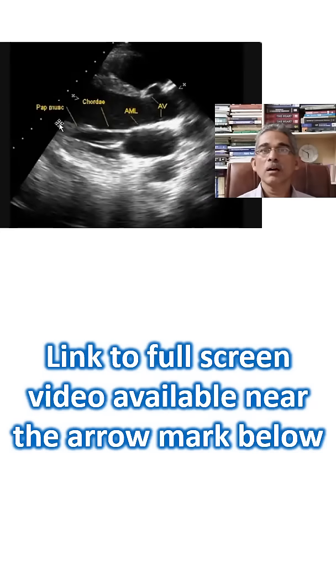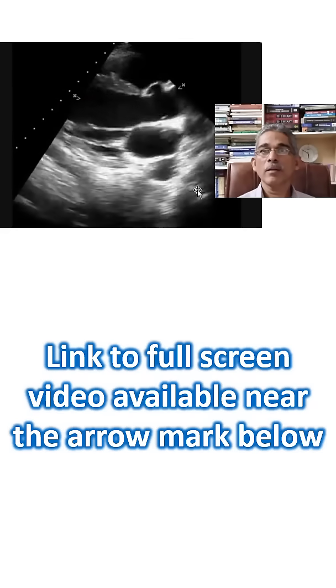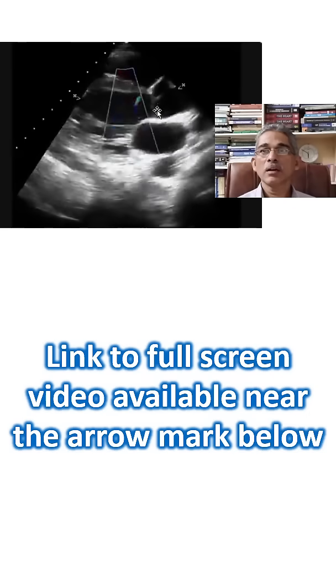Now you can see it, and here you can see the papillary muscle, chordae, anterior mitral leaflet, you can see the aortic valve there.